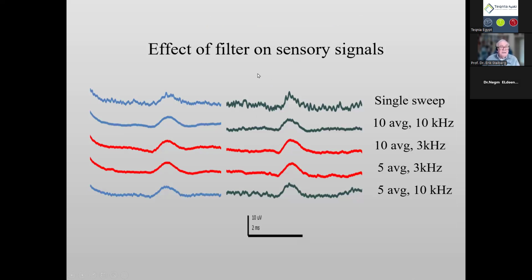When we do the sensory recording, it is important that we try to get rid of artifacts. And you do that in the averager in your EMG equipment. But another good thing is to start with removing the high frequency signals. Then it is an easier job for the averager. So here is the raw signal.